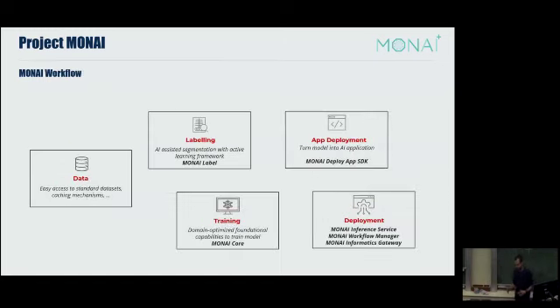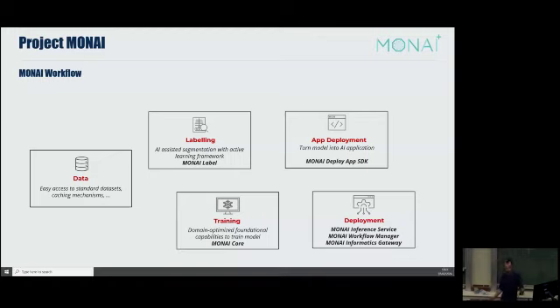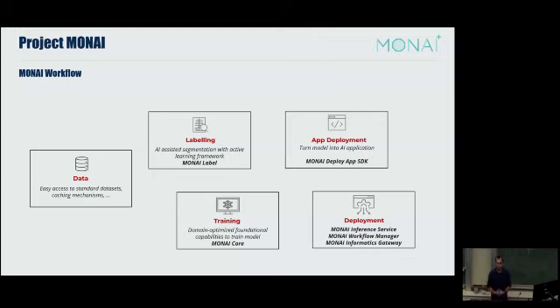And then as well, MONAI is trying to cover the full life cycle of an algorithm, or the full data flow of an algorithm. At the beginning, we've got mechanisms to load data. Usually medical image data are rather large, so you want to minimize I/O from disk because it costs you a lot of time. So we've got caching mechanisms that rely on some of the properties of medical imaging. But if we move from left to right, we think of all of the workflows that are required so that we can develop, train, and then deploy an algorithm within a clinical environment.